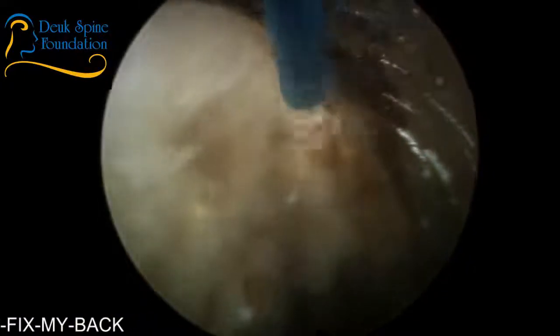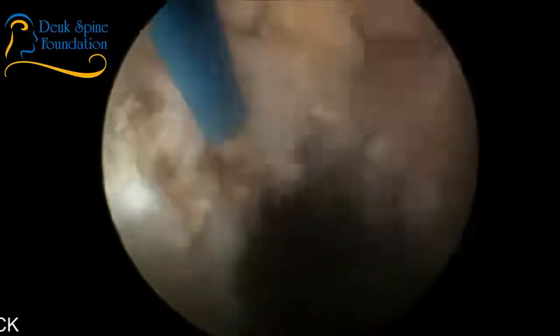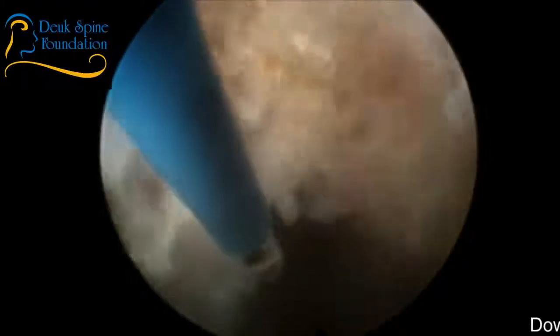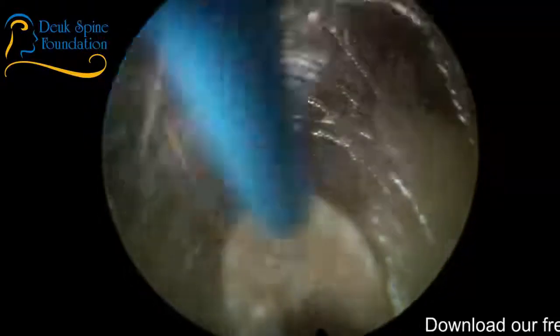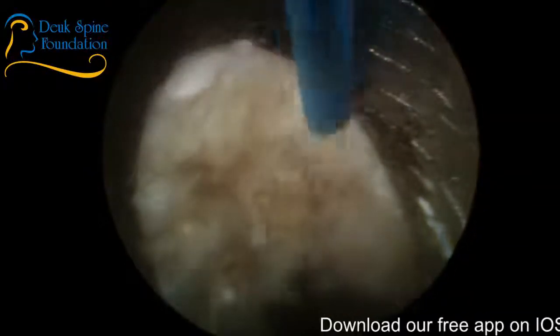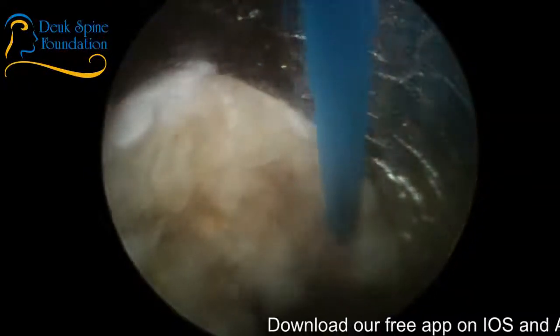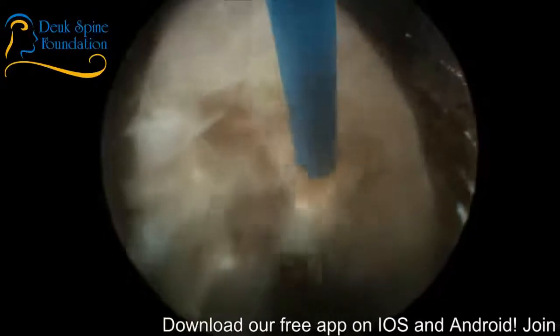Problem is, most people aren't capable of doing that. I should rephrase that. Everyone's capable of doing it. Hold this here. Hold this right there. Don't let the tube twist. People just don't do it for whatever reason. They're not familiar with it. They haven't been taught to do it.